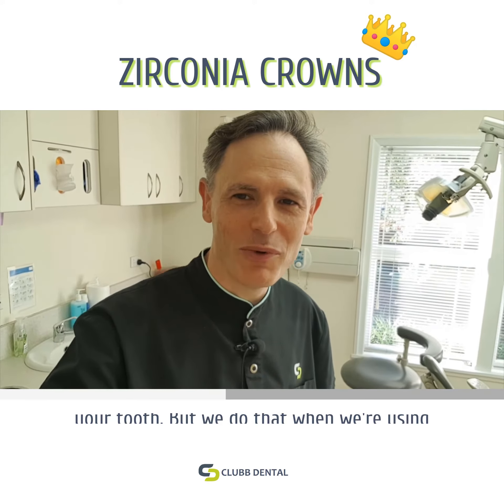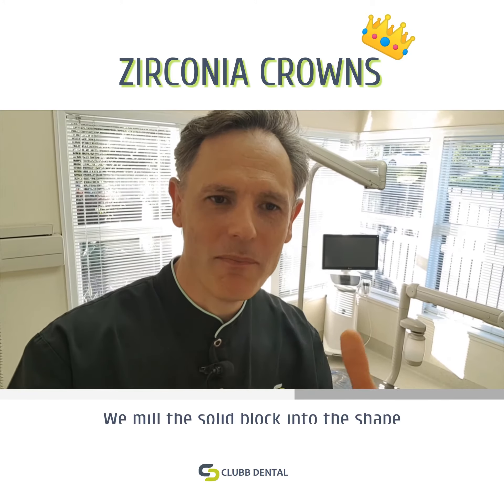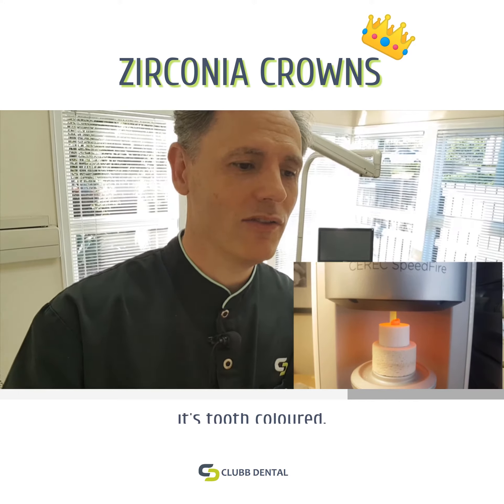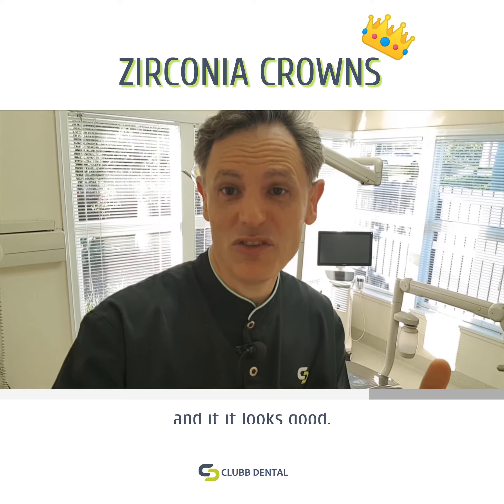If I can turn this — that machine there in the corner. We take a scan of your prepared tooth, we mill the solid block into the shape of your tooth. It goes through the oven up to over 1,500 degrees Celsius, and when it comes out it's tooth-colored. It's very precisely fitted to your tooth and it looks good.